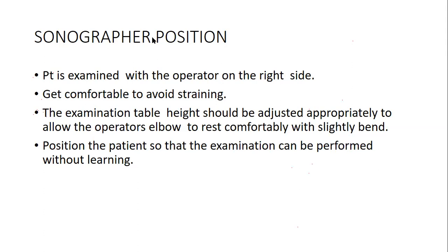With the advent of COVID also, you always avoid unnecessary contact with the patient. And then I prefer to examine my patients, not only with echo, but I think I've adapted. Always get your glove. If you have the gloves, get your glove just on one side and then do your technique like that. We'll explain.